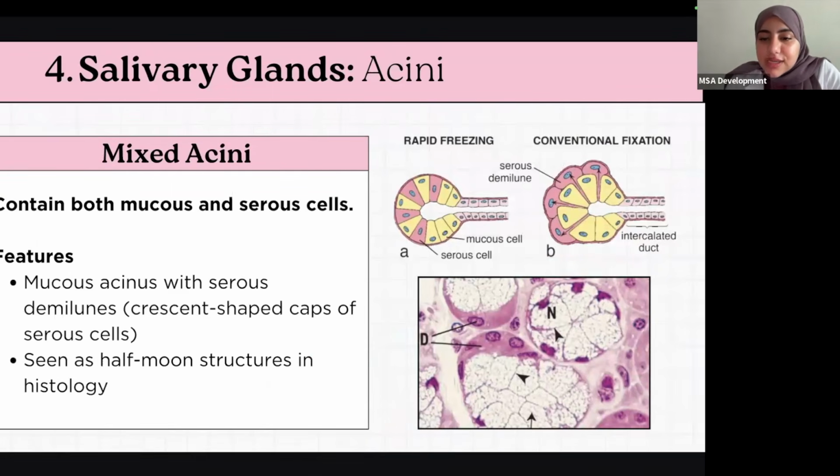Now, there are mixed acini, and over here they're talking about the fact that when you're doing a pathological slide, you can't preserve the tissue in its full essence, right? There are always some problems, and this is how it happens. So there are mixed acini, which are serous and mucus. Another way that it can form is if the mucus is like this, and there's something called serous demilunes, like lunar, half a moon. It kind of looks like this. It's like hugging the mucus acini.